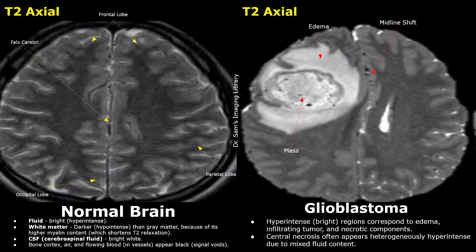Here is another T2 image showing a glioblastoma. The hyper-intense mass can be seen with a slightly heterogeneous and hypo-intense irregular border, and it is surrounded by vasogenic edema, which also appears hyper-intense. Midline shift is noted due to the mass effect.